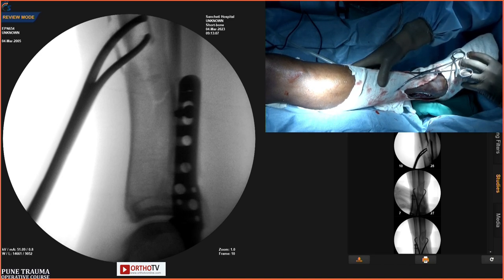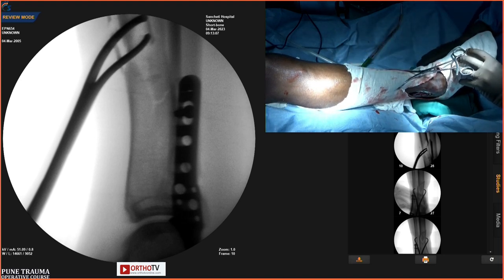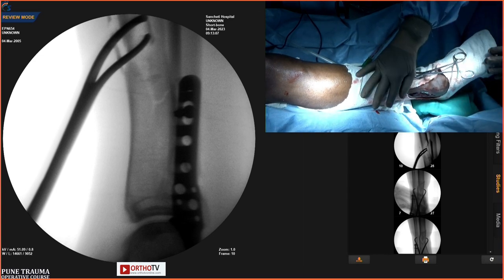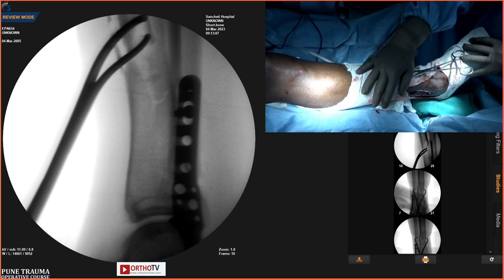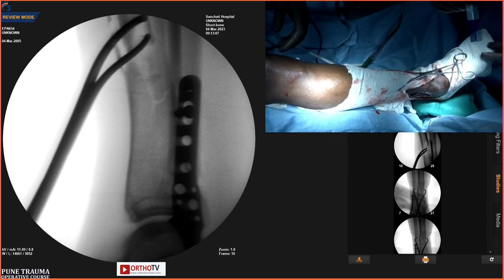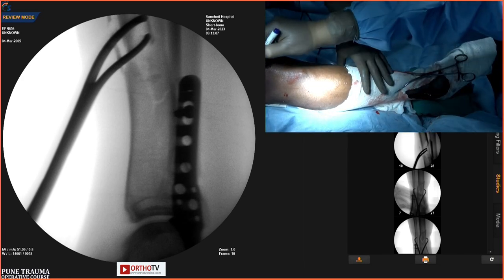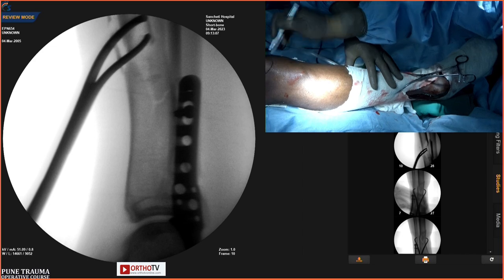Question to the panel: supposing instead of this, the tibial fracture is a comminuted one. Supposing it was a transverse fracture, could we have just done a minimally invasive nail for the fibula instead of an open plate? If the fracture of the tibia was transverse, where you are anyway going to nail it, the fibula is not amenable to any nailing procedure. This requires a plate, there is no debate. What we are talking about is whether to fix it first or not.